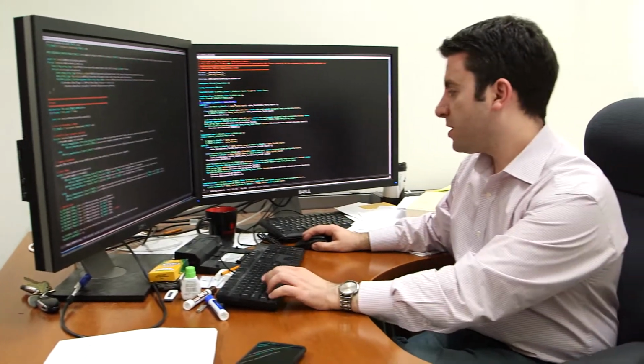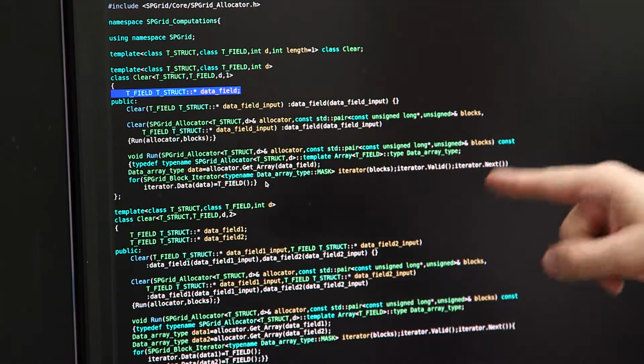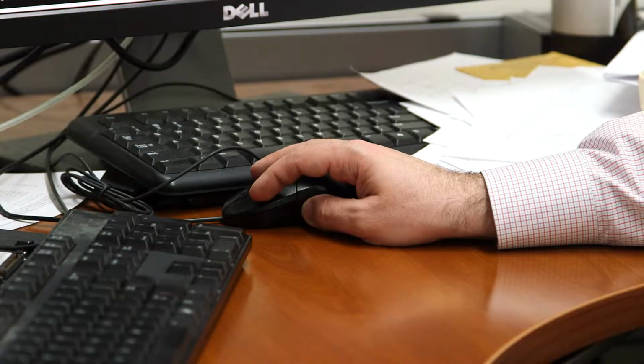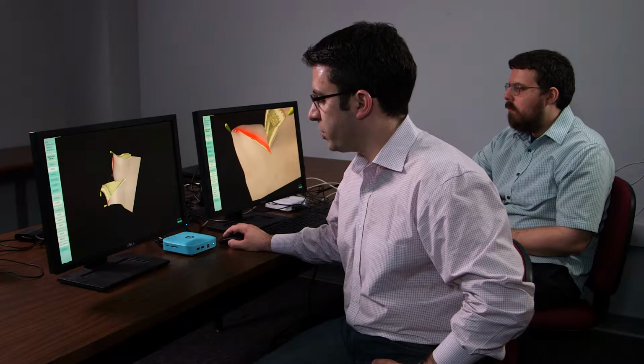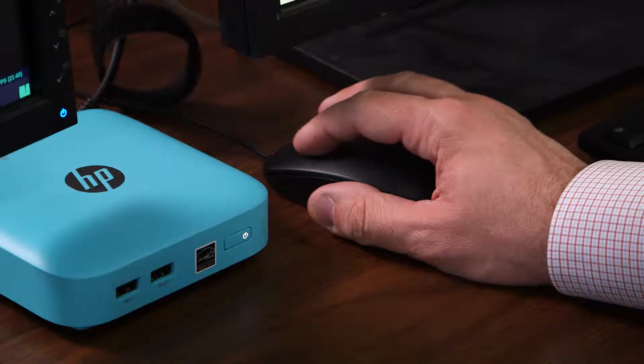It is a little bit surprising to me why a system like this has not been already deployed. In some sense, all of the technological building blocks are already there. We've made considerable progress on this tool since we started several years ago. We have expanded from very rudimentary applications to something that is now deployable on a network and can stream surgical operations to your ordinary web browser. Moving forward, we have a lot of work to do yet to make the simulation seem more realistic.